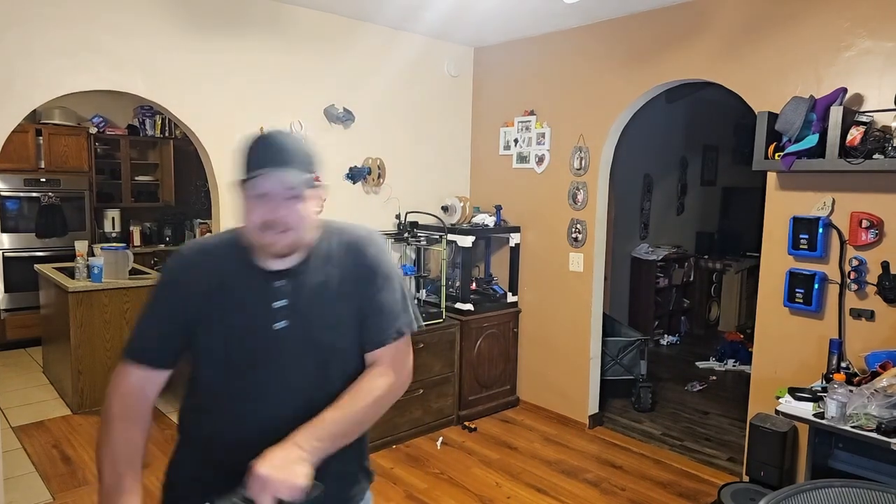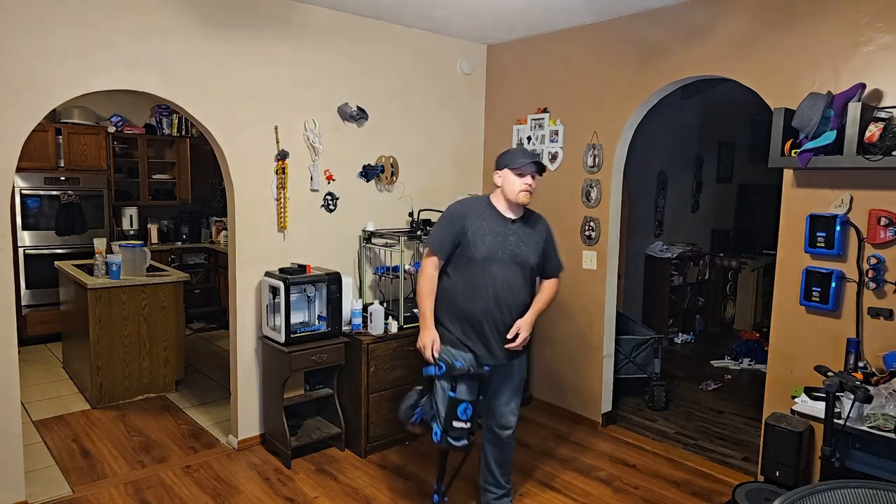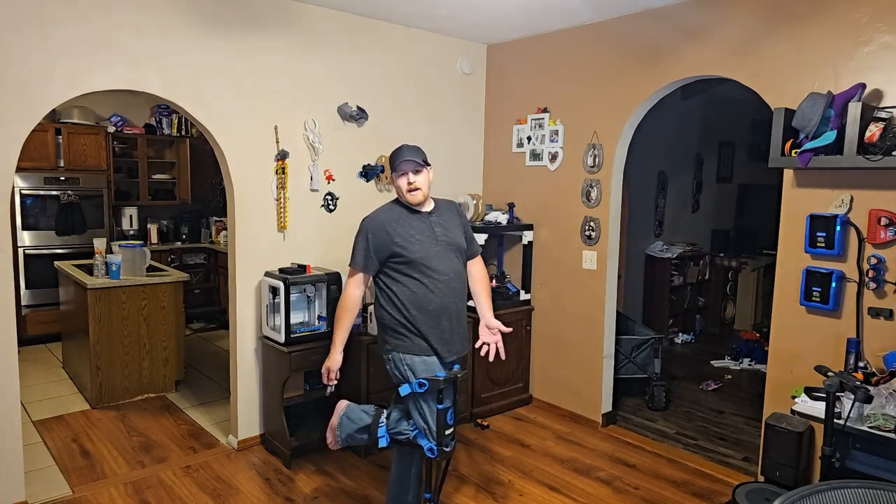I like riding scooters as much as the next guy. That fall wasn't part of the plan, but it illustrates a problem. The point of this video is to give you a pros and cons between two different options: one is that scooter I was just riding, the other is this less commonly known iWalk i3.